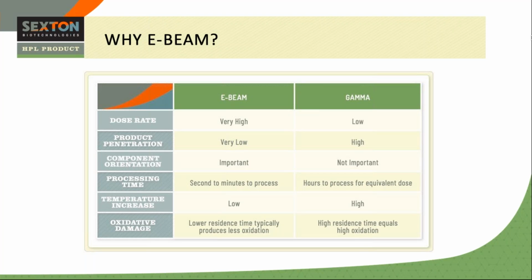For us, we began looking at inactivation as it's fairly well accepted for other raw materials such as FBS and sera. And so we began a full, robust development project to determine the best method for inactivating an accepted panel of viruses whilst trying to maintain product performance.